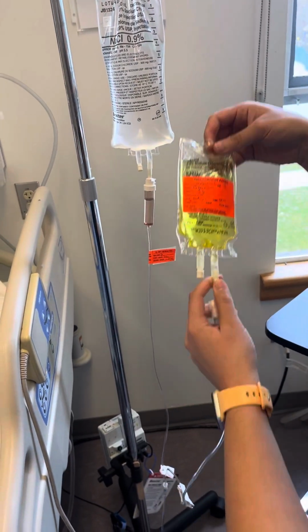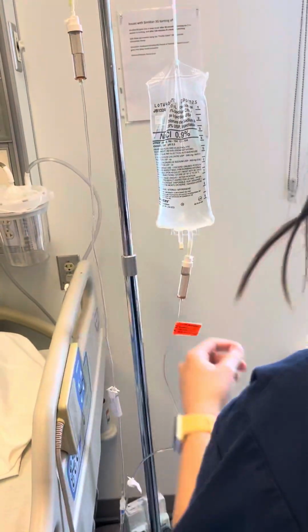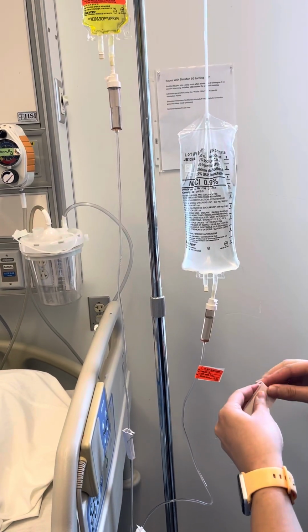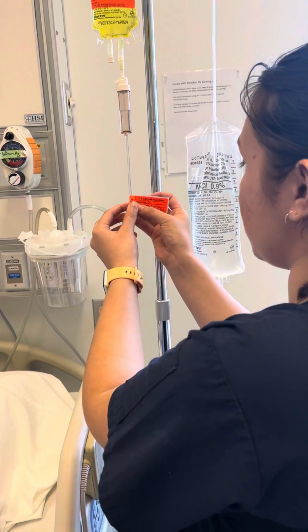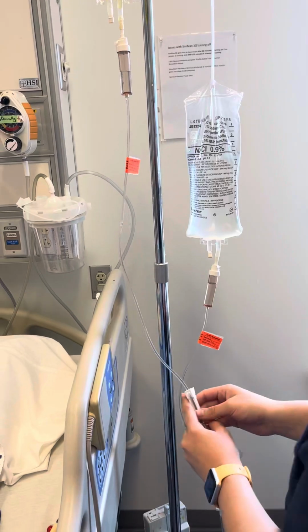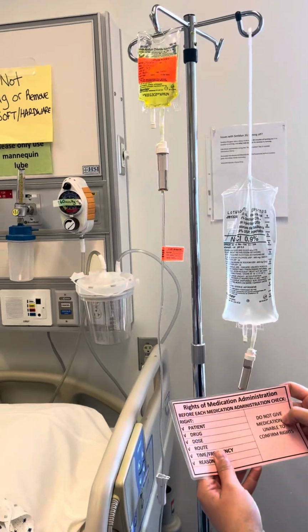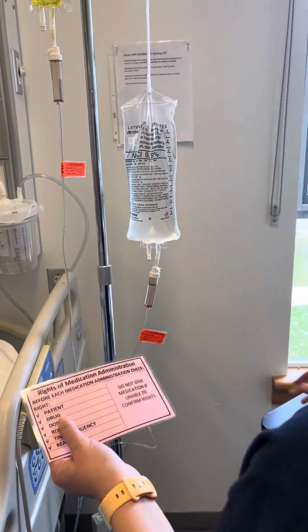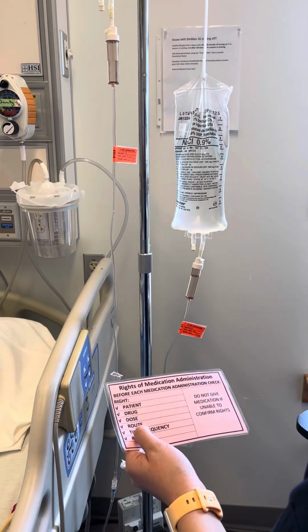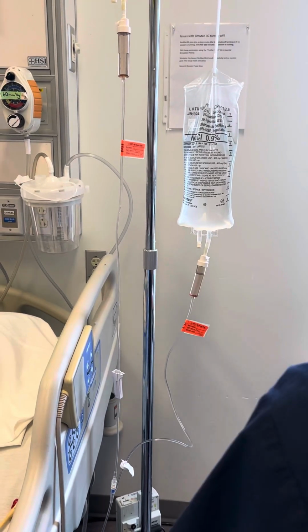Okay, that's in. So you want to hang this above the primary line. We've got our medication label there, and we're going to put our line label on it as well. Like that. Okay, next thing we would want to do, like I said, medication check. So the medication hasn't gone through yet. Patient, yes, correct. Generic drug, cefazolin, dose 1 gram. Route IV, time, frequency, every 8 hours. Reason, it's an antibiotic.